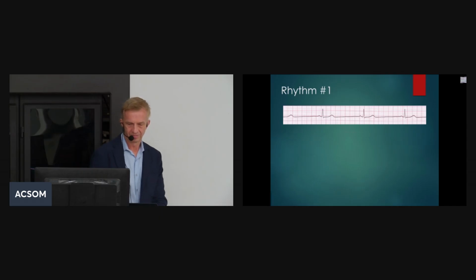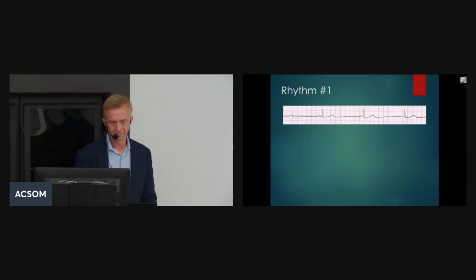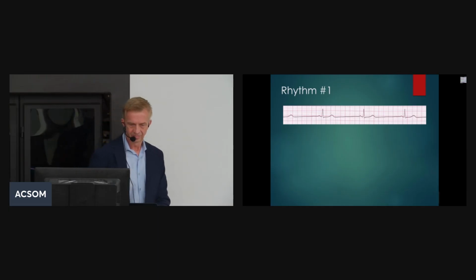So what is this? Is the PR interval long? This is the PR interval. It's less than one big box, so the PR interval is normal. The RR interval is long, right? So how many big boxes? 1, 2, 3, 4, 5, 6, 7, 8, almost 9.